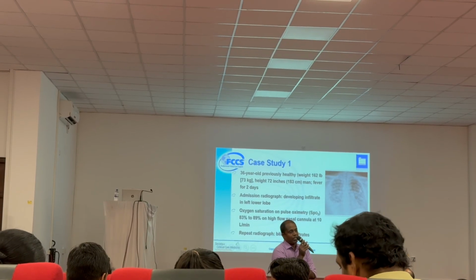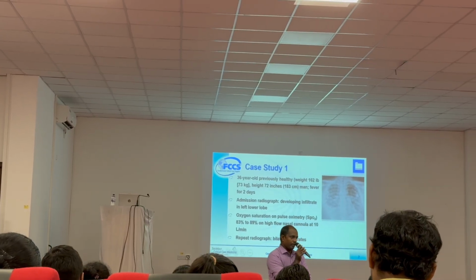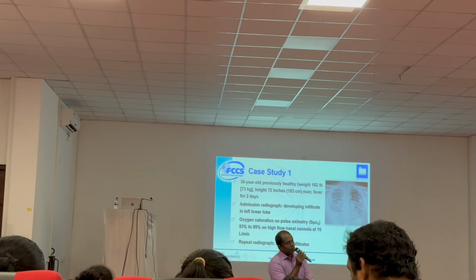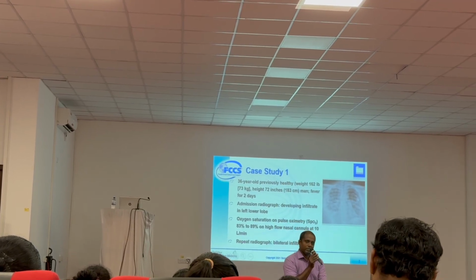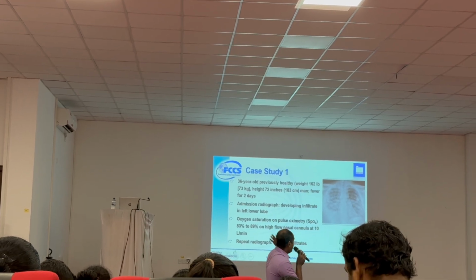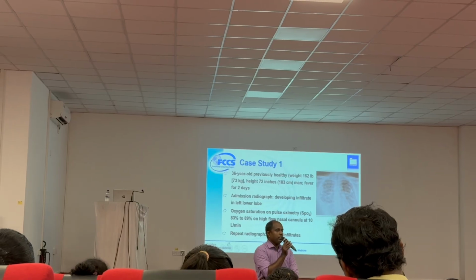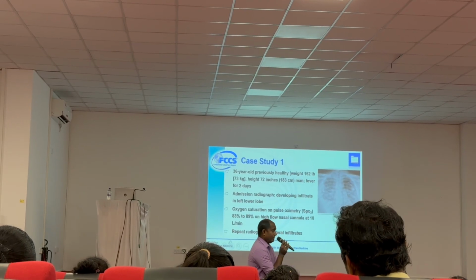If you give more tidal volume, you give more pressure and more energy, and you damage the lung. So even when you want to improve the oxygenation, it is better to keep a low tidal volume. Whatever we study in the next three cases covers this. Tidal volume is directly related to the pressures reached.